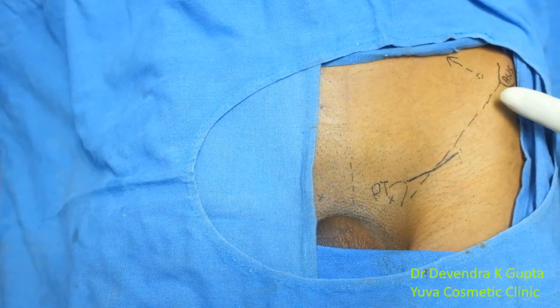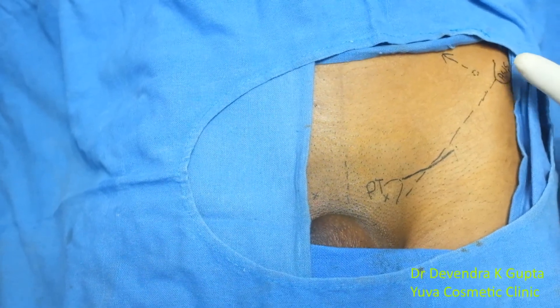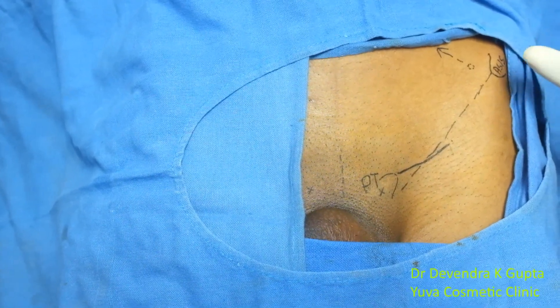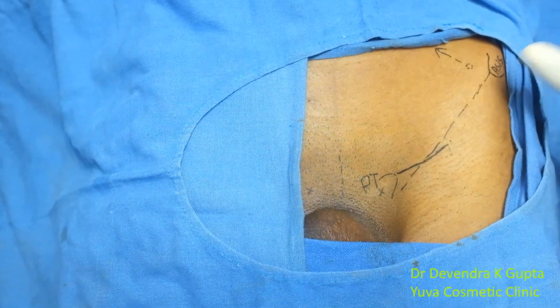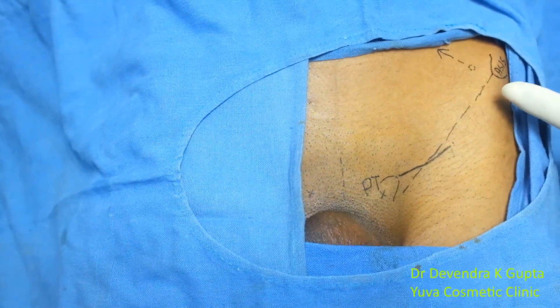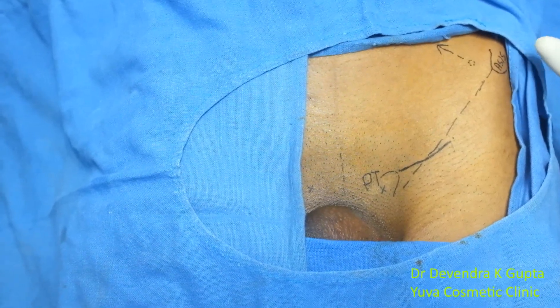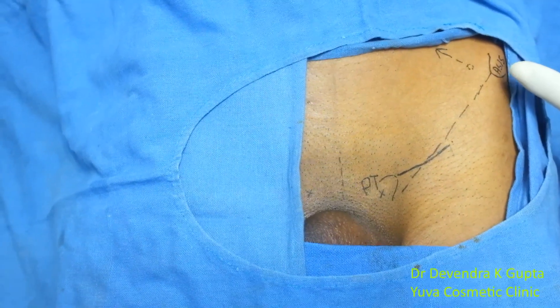I have taken a point for entry of the needle just above and medial to the anterior superior iliac spine. After puncturing the skin, you will feel a little resistance because of the external oblique. After this resistance, there will be a loose irregular plane between the external oblique and internal oblique, and in that same plane I would like to inject 5 to 10 ml of local anesthetic solution.